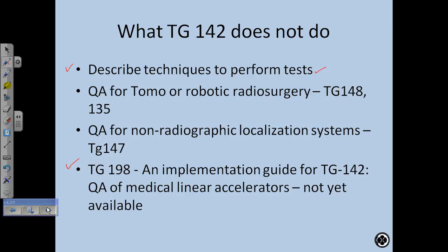So if you're following a certain procedure from your manufacturer of acceptance testing, and you're writing down the results you get at that time, you either pass it or fail it. Hopefully it all passes. Those are your baseline values. So why not use that procedure on a monthly or quarterly basis and compare your results to your baseline? So that's what I do.